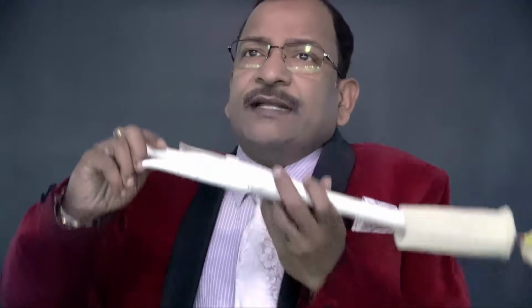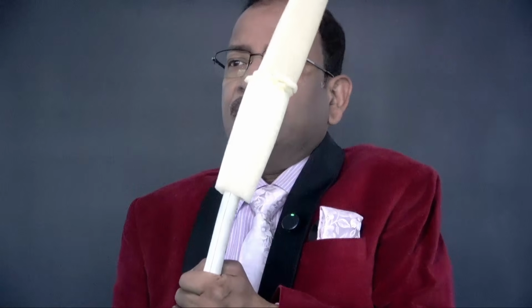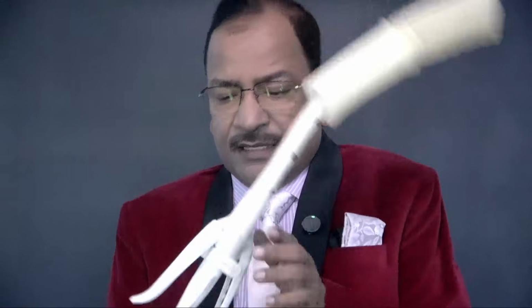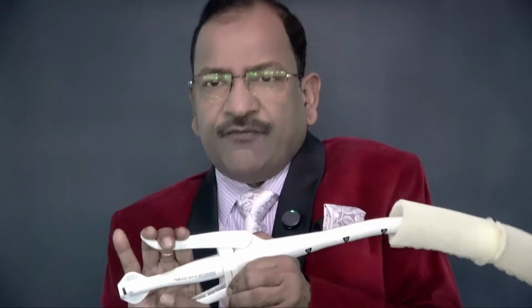And then your second surgeon will rotate it clockwise. And you can see the anvil and gun are approximated. And then there is a safety here, press it and fire. And once you fire, anastomosis is complete, surgery is over. This is a used one, so that's why I cannot fire, it's not firing, because it doesn't have the cartridge. So this is the safety.